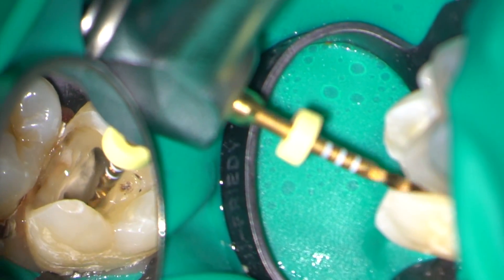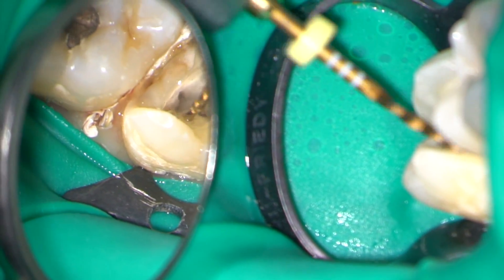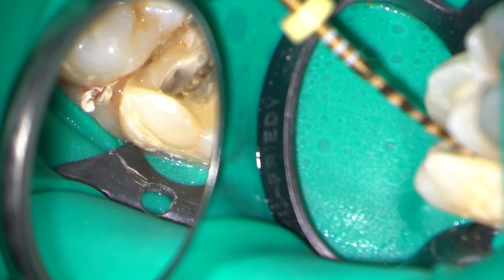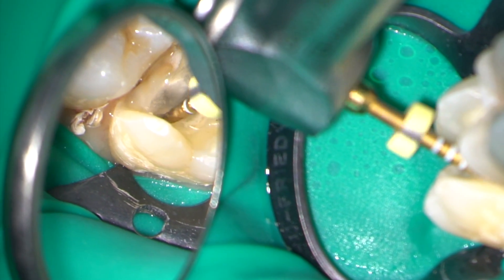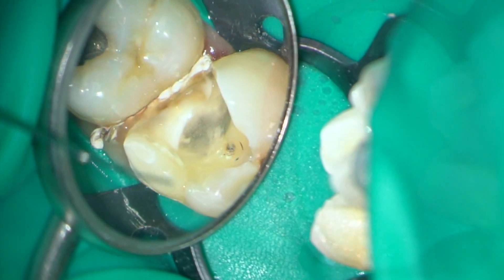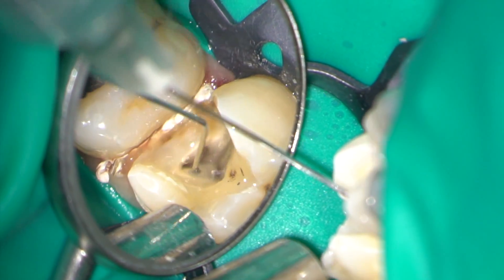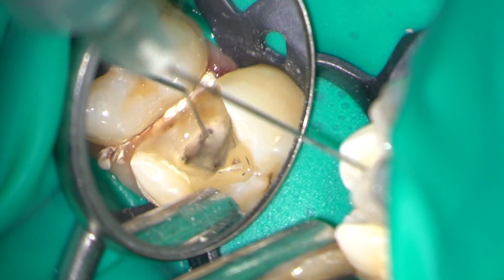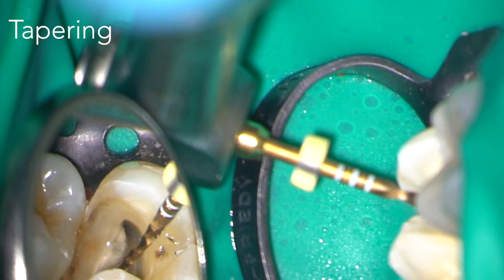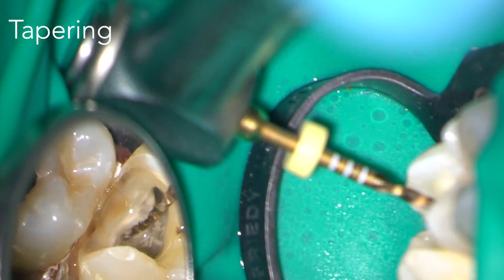Having created a glide path in all the root canals, it's now time to rapidly taper them. Any rotary or reciprocating nickel titanium file system will do this very efficiently and safely. In this case I used the Wave One Gold system using three files per canal. The buccal canals were all prepared to a primary instrument and the palatal canal to a medium.